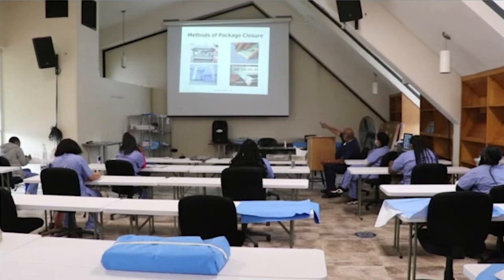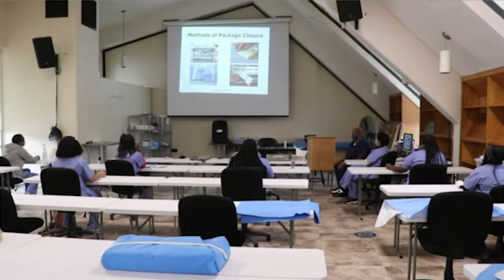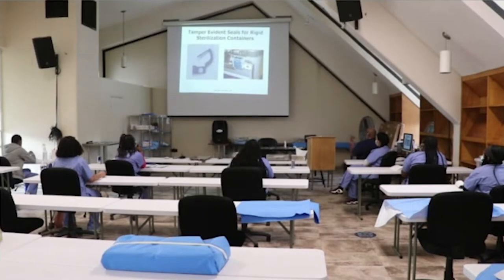Notice the technician in the top left is putting in a tamper evidence seal and it looks different than the one that I gave you. Those are the arrows. It's still the same thing. It has to be locked. There's the heat sealer we were talking about at 5 o'clock, where the technician is sealing an envelope, just like the instrument with the two fingers on the end, except using a heat sealer. Tamper evident, make sure that it wasn't damaged. Two different variations of what your tamper evidence seal looks like.